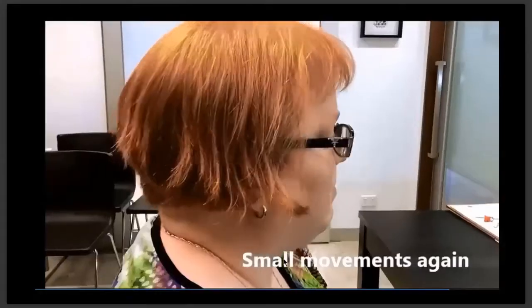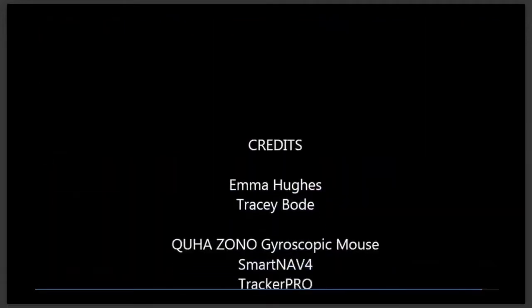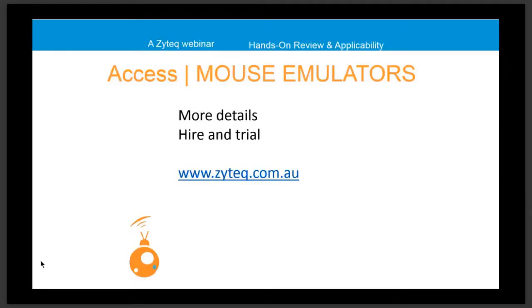So to conclude this segment on mouse emulation, you can see that there's a wide variety of devices providing mouse emulation. This means you can use an on-screen keyboard to do everything on a computer that would otherwise be carried out with a keyboard and mouse or touch screen. So it's a matter of finding the right device to match the movements of the person who will be using this alternative device. For more details and hire and trial details, please check our website and we'll see if we have something to suit.